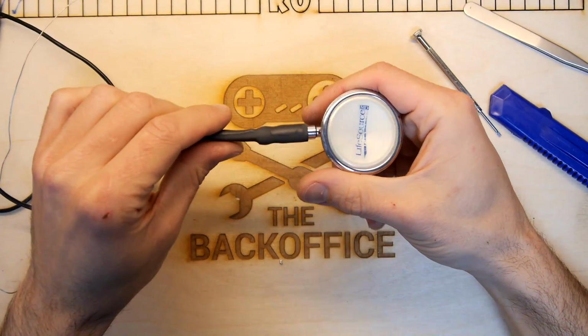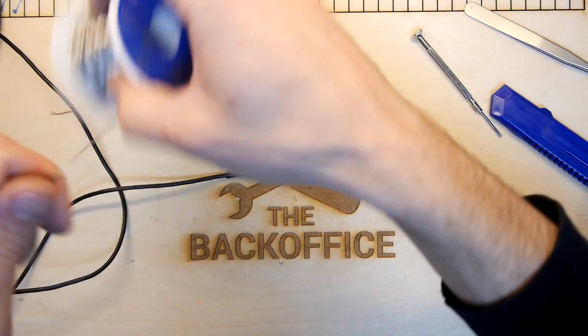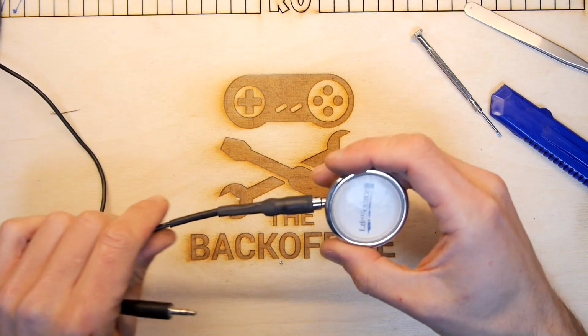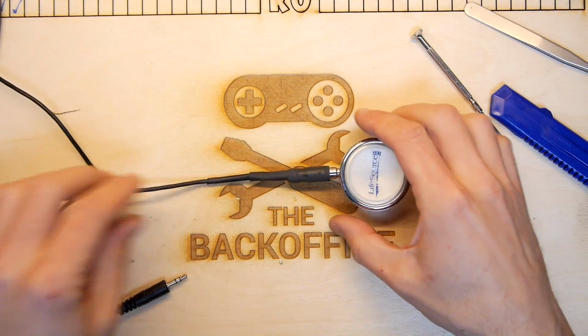So there we have a stethoscope. All that remains, I think, is just to go over to the computer and have a play. I mean, I can just try plugging it into the camera, but I don't think we're going to learn anything from that. Let's test this out over at the computer.